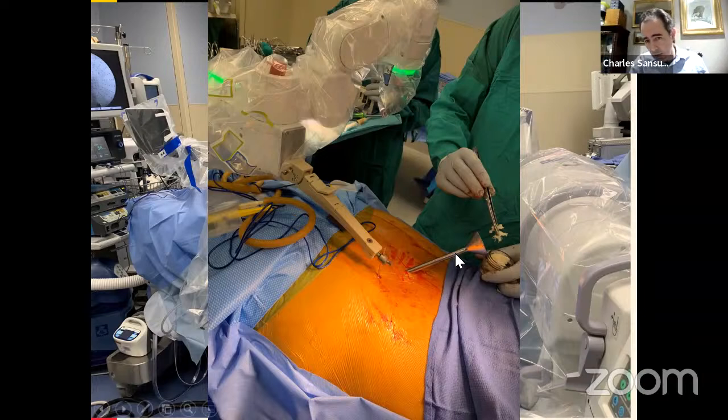This is a close-up of packing the SI joint with the funnel — approximately nine millimeters in diameter — offering an opportunity to really get a good arthrodesis.